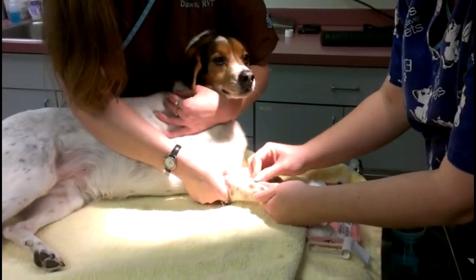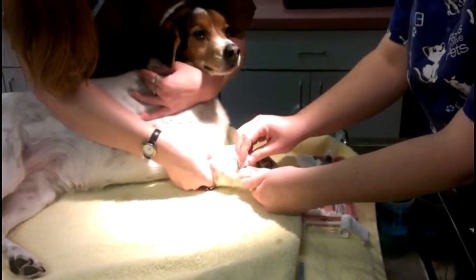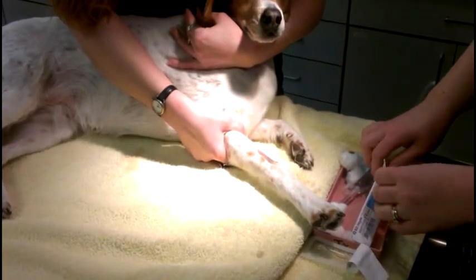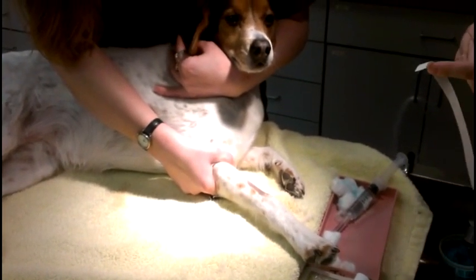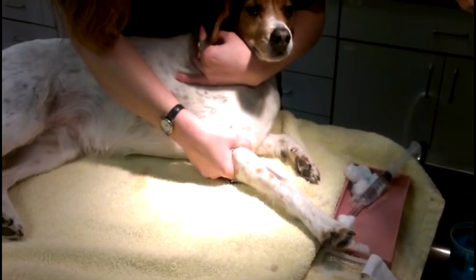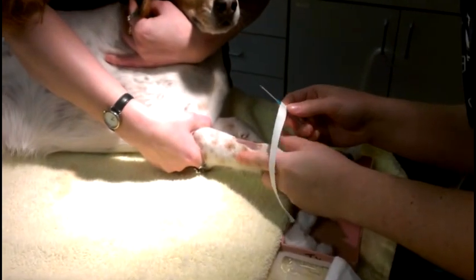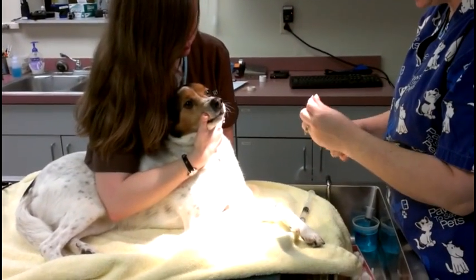Clean up the vein using a little bit of antiseptic. Has her IV catheter in. We're going to go ahead and give her her anesthesia.